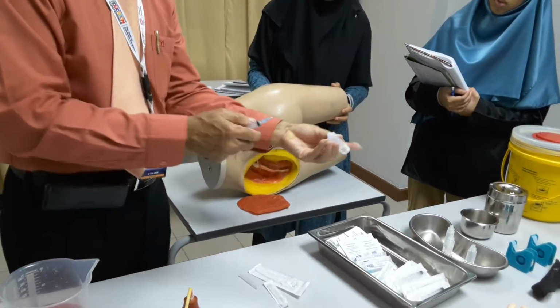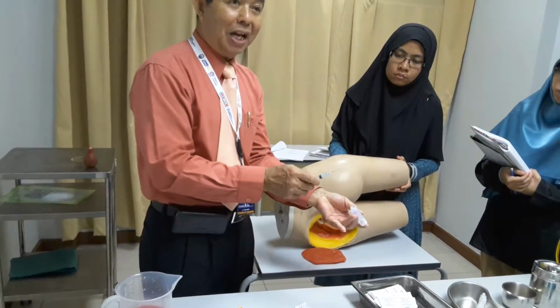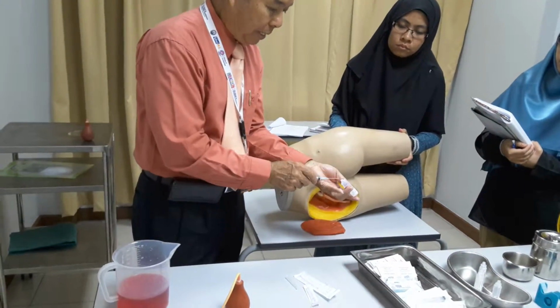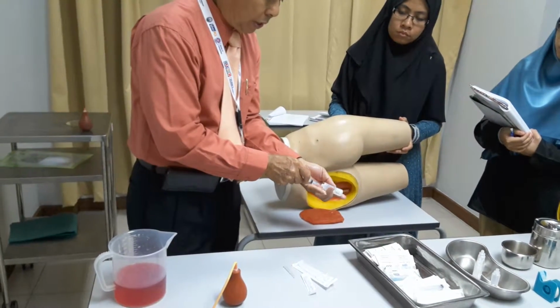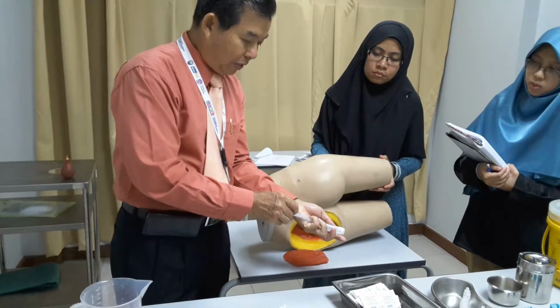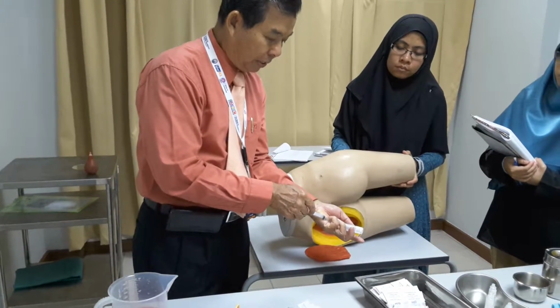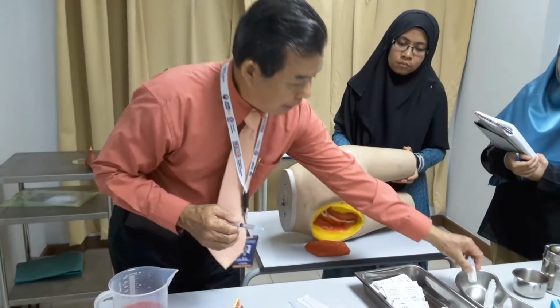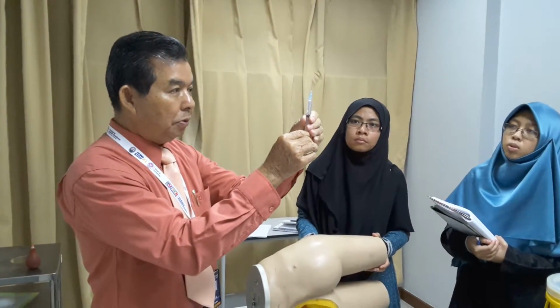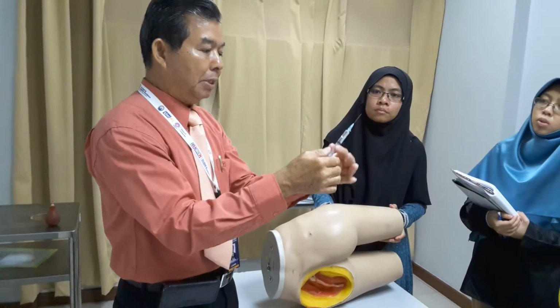So for that, look at the way how I keep my fingers. Every finger is utilizable. Okay, here now I'm going to suck the contents from this, assuming that this is the medicine. Without touching the margin, now you see you hold with these two fingers so that you can just suck simply. Something like maybe 1.5. Okay, finish. Now here is some pocket of air, so you pump up a little bit. Now it's about 1.5 plus. Never mind. So this is the content.